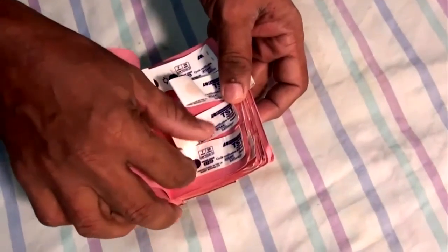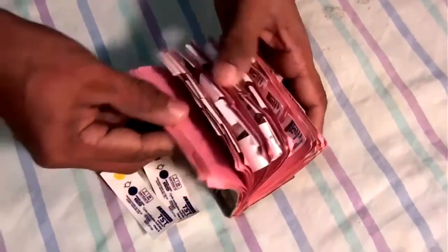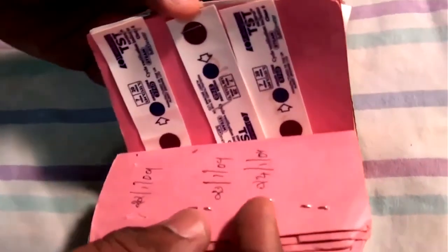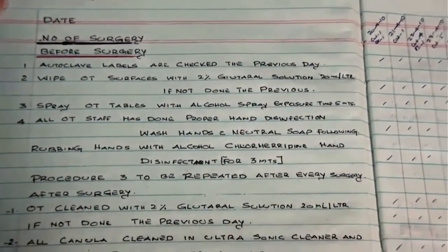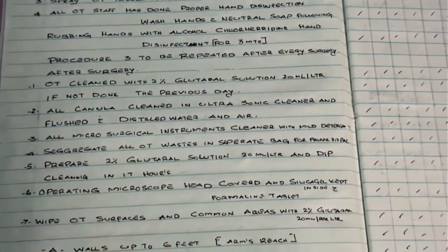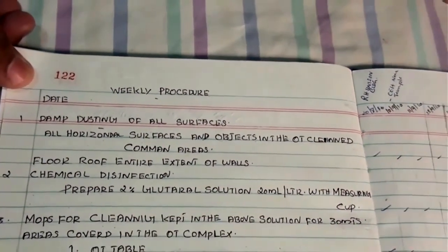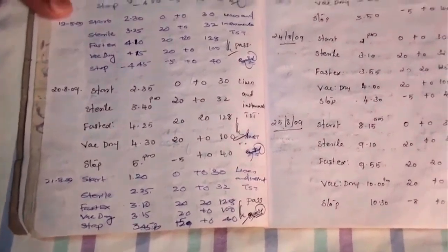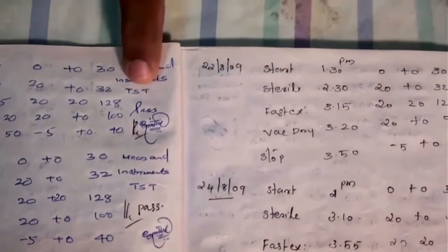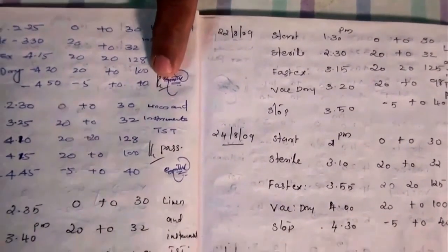Cidex is too. And always keep your records properly. Maintain all the indicators or whatever you have done. Retain it, and have registers with date, the different procedures you have done, counter-checked by your medical person and the staff. These records will be of very, very great help at the time of a problem. This is the autoclave register, which says when, what time it started. Now these automated ones have printouts. You can maintain the printed papers that you get.